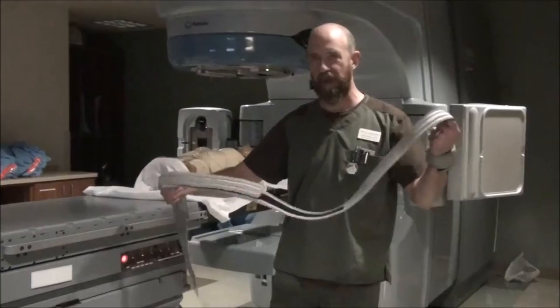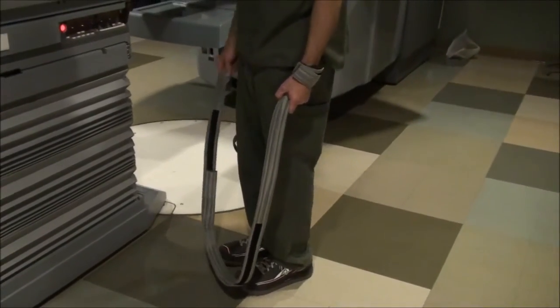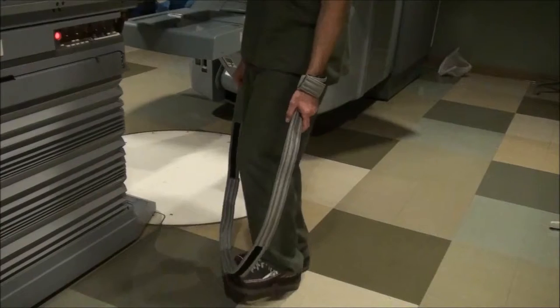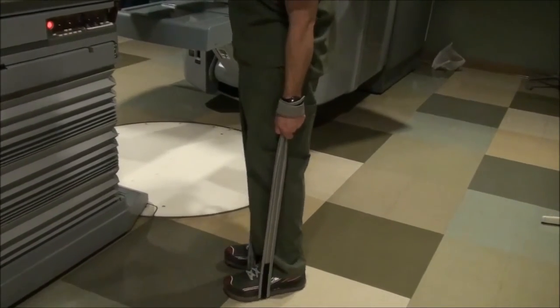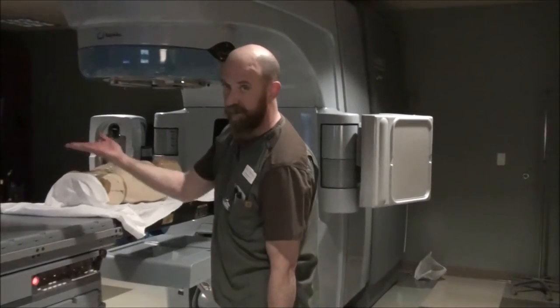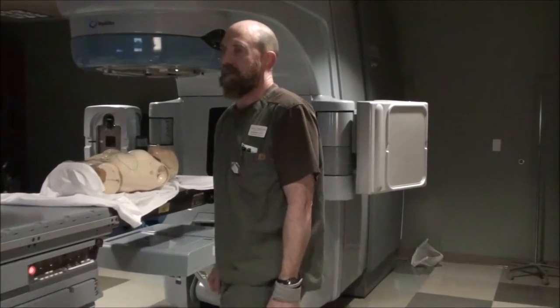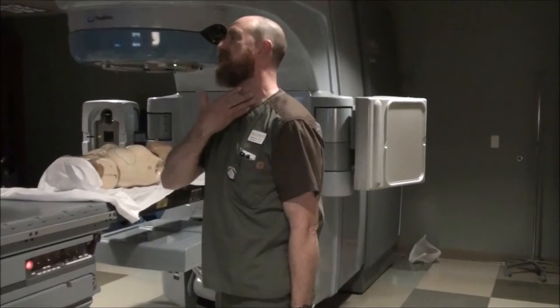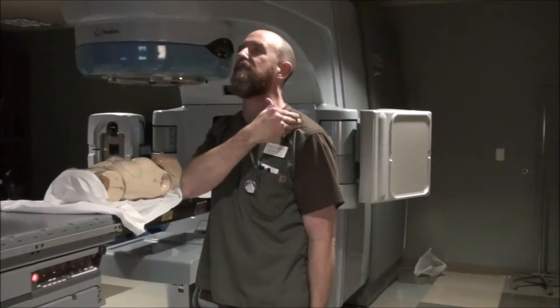If you do need to do it, you're going to have a strap around both wrists. The patient is going to lay with flat legs — you don't want to have a knee rest. You will bend the person's knees up, pull the strap relatively tight, and then have them straighten their knee out. What that's going to do is pull the shoulder inferior. You're going to be pulling the shoulder down to open this up so that you can get into the neck. You can do this for any head and neck simulation.